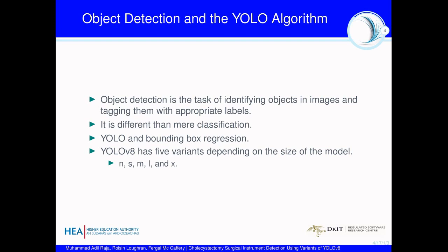As opposed to posing it as a classification problem, it formulates the problem as a regression problem, in which regression is performed between the bounding box coordinates of the target image and the bounding box coordinates predicted by the model.